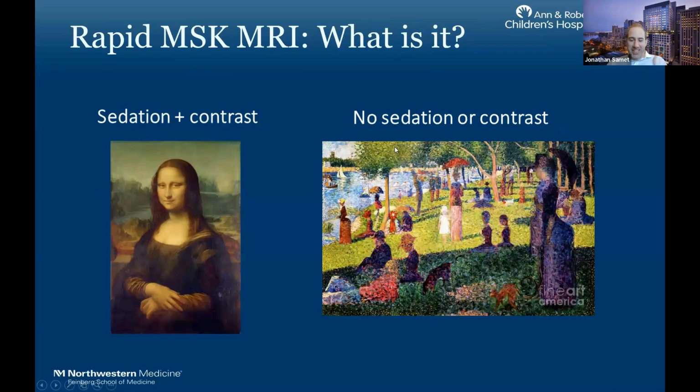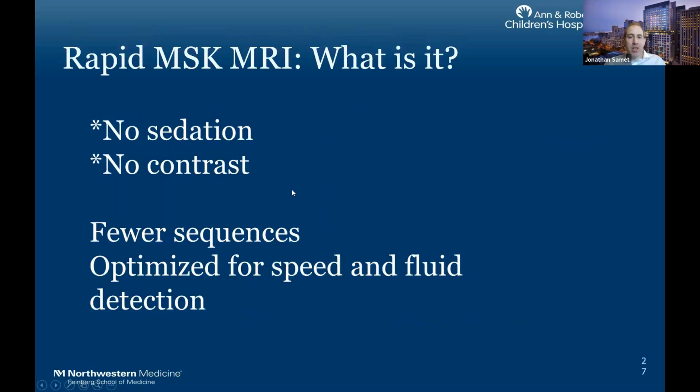If you take away sedation and contrast, you get a Seurat, okay? You have the multiple dots, right? And when you go really closely, you can't really figure it out. But when you stand back, you say, okay, I know what this is. So you have enough information to figure out what's going on here, the picnic, the water. It's not as beautiful of a picture necessarily, but you still have what you need. That's a rapid MSK. So we don't give sedation and we don't give contrast, okay?